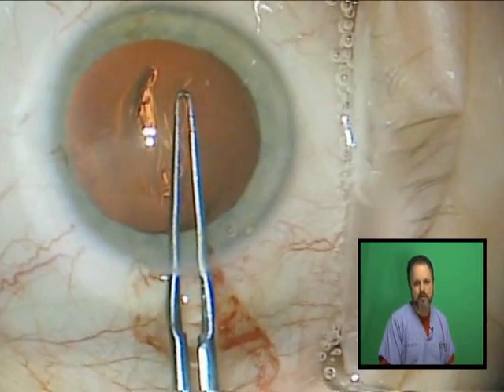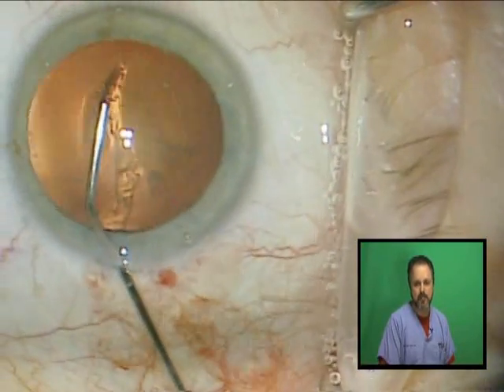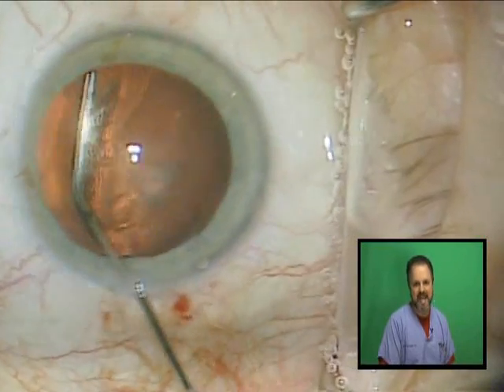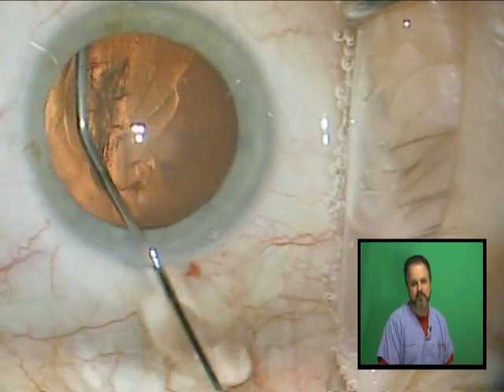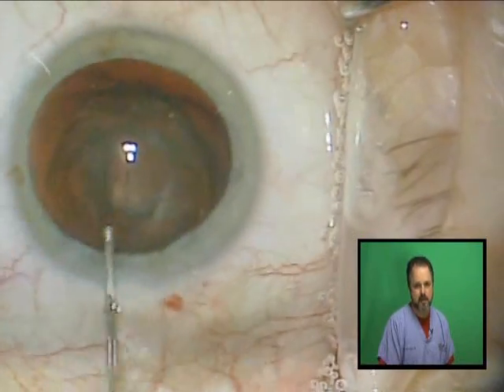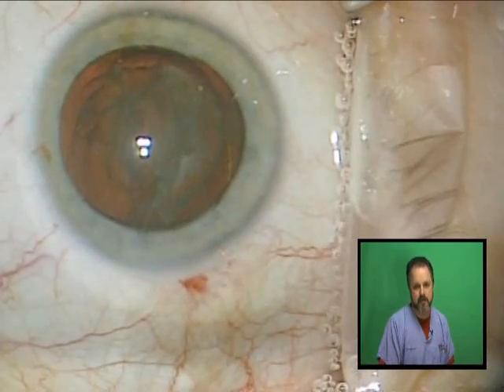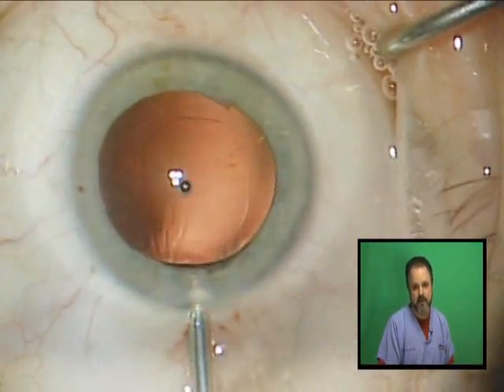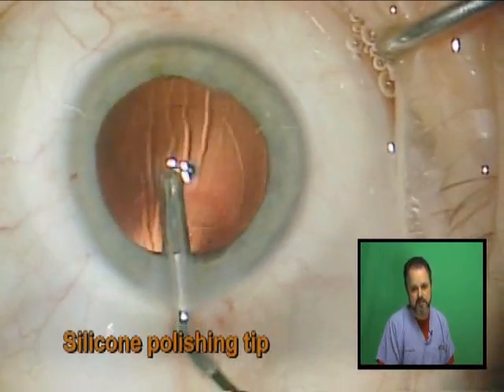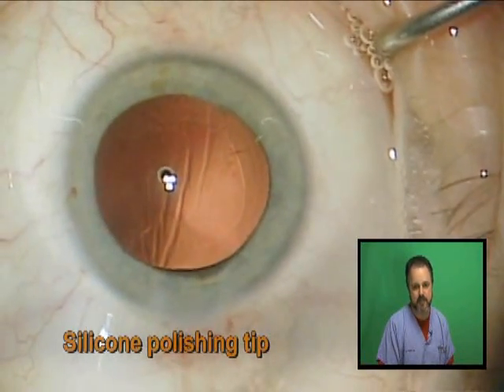After the capsulorhexis I proceed with good cortical cleaving hydrodissection, then proceed to phacoemulsification and irrigation aspiration of the rest of the cortical elements. I believe with the Crystalline it's very important to clean the posterior capsule. If you see any posterior cells, go ahead and polish them. I prefer a silicone polisher and I'll even polish the underside of the anterior capsule leaflets.